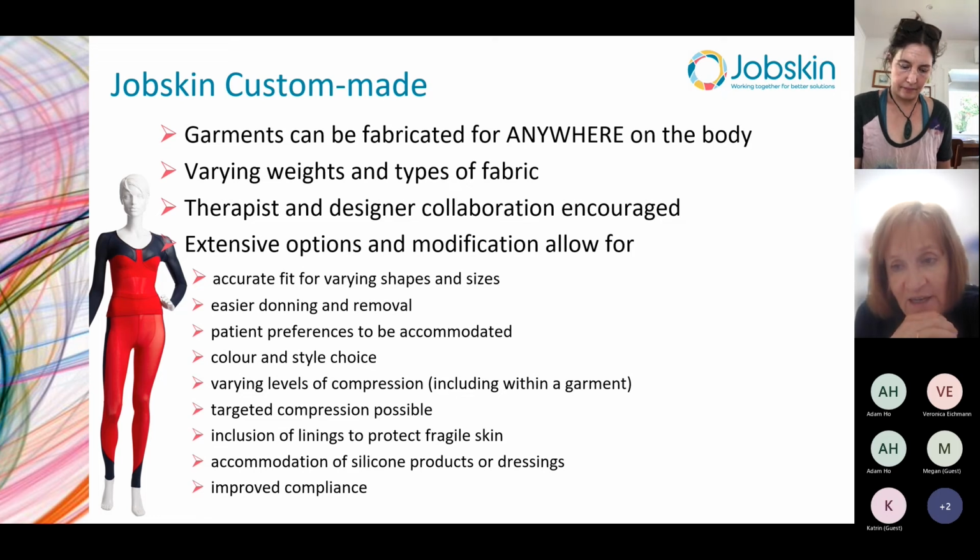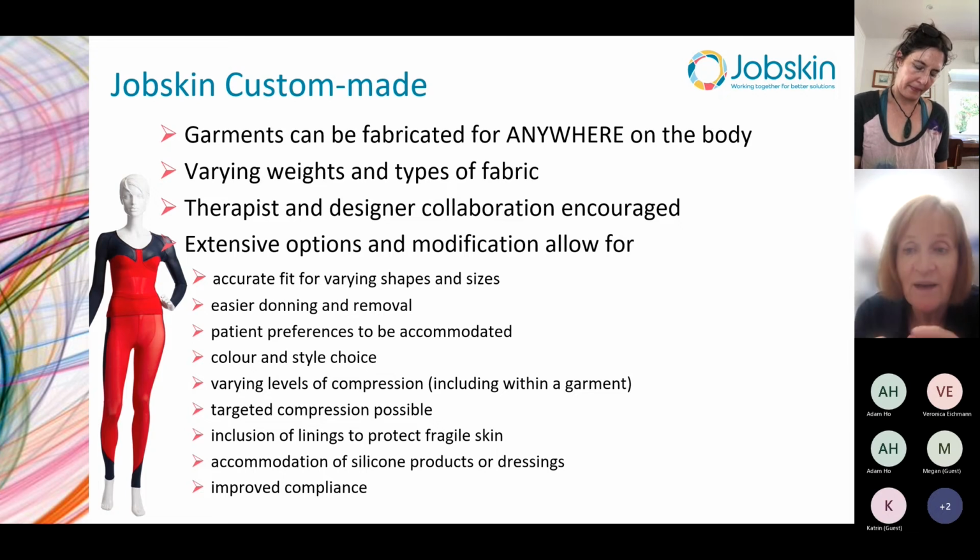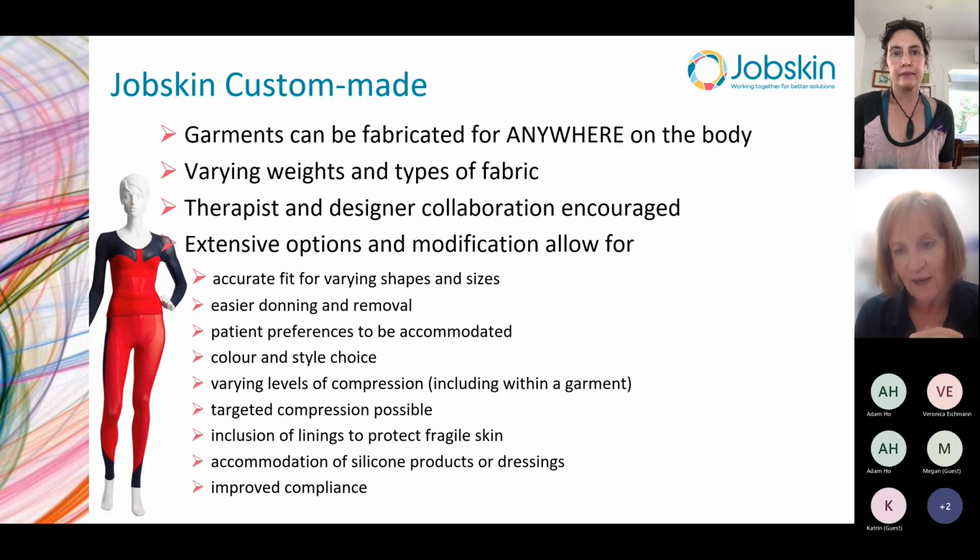But in fact, it does last the life of the garment. It's far less of a burden on the patient, and it's really great for small areas like fingers and toes and hard to reach areas that are hard to tuck silicone sheeting into and onto. And when we're able to line up the options like that, accommodating preferences, it's a good fit and clinically effective, then undoubtedly we're going to get improved compliance from the patient.